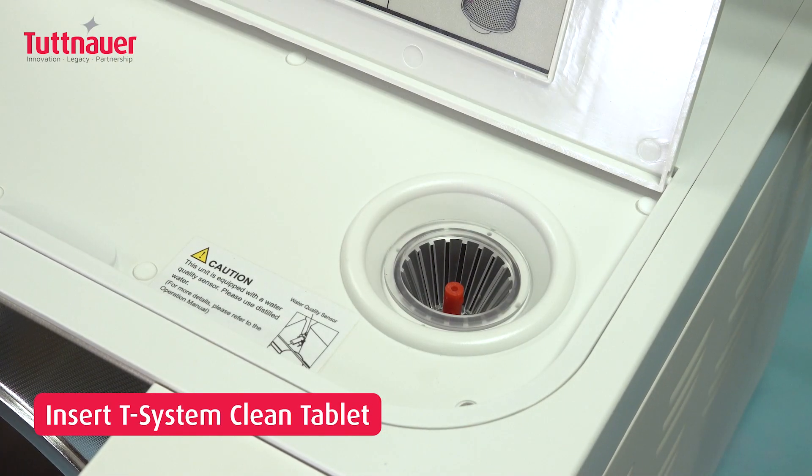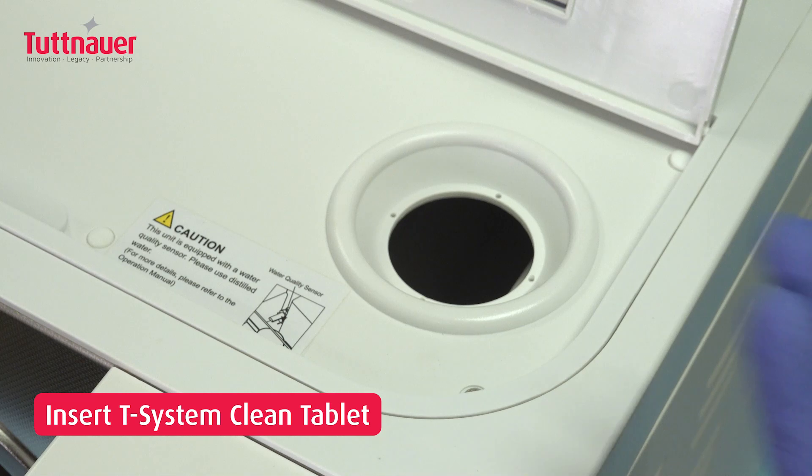Open the clean water tank, remove the filter, and place the T-System Clean Tablet inside.